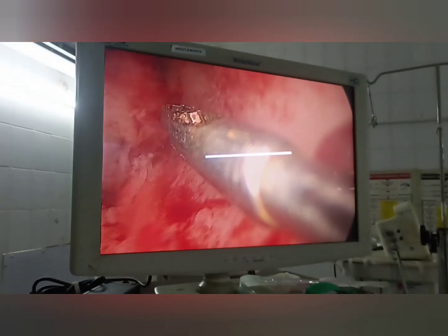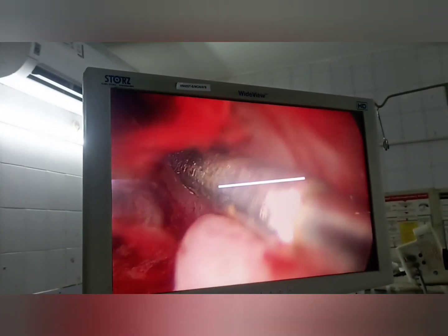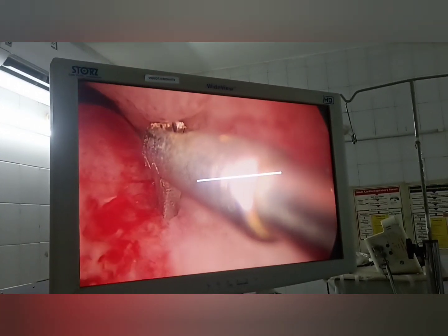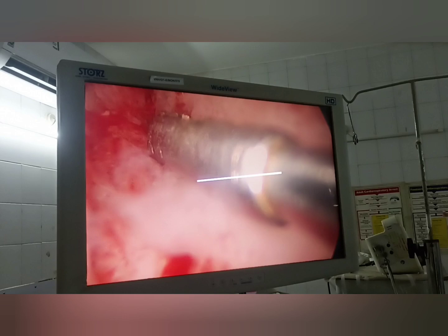This is the base of the polyp. With the help of hysteroscopic scissors, gentle small cuts are made at the base of the polyp. The cut should be such that the full stalk or the base of the polyp is cut, and we should not dig deep into the endometrium to avoid its damage.